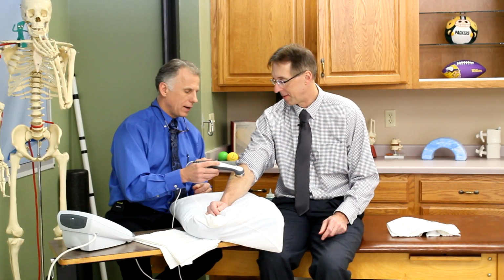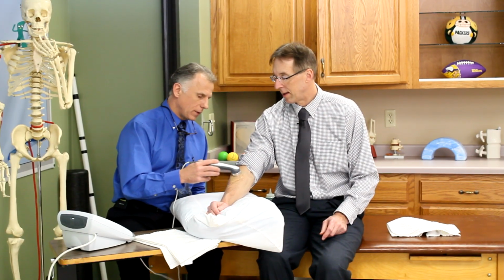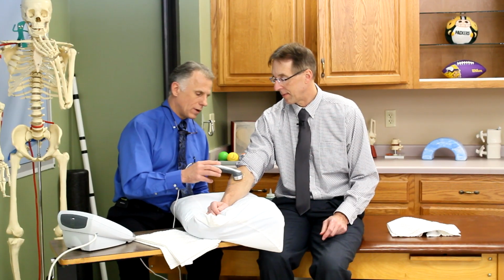Exactly. And also the megahertz, the frequency. Most professional ones have 2 options, 1 megahertz or 3 megahertz. We usually use the 1 megahertz to get deeper. Sometimes we might use a 3, but on a home unit, the ones I've seen were at 3 megahertz. From the study I read, you cannot go more than 1.8 centimeters with the 3 megahertz. With the 1 megahertz, you can go down to 5 centimeters, so you're going to get some real deep heat. So just a precaution if you're looking at buying one. And then you're just going to work it here. You don't want to work it so the head goes off like this.